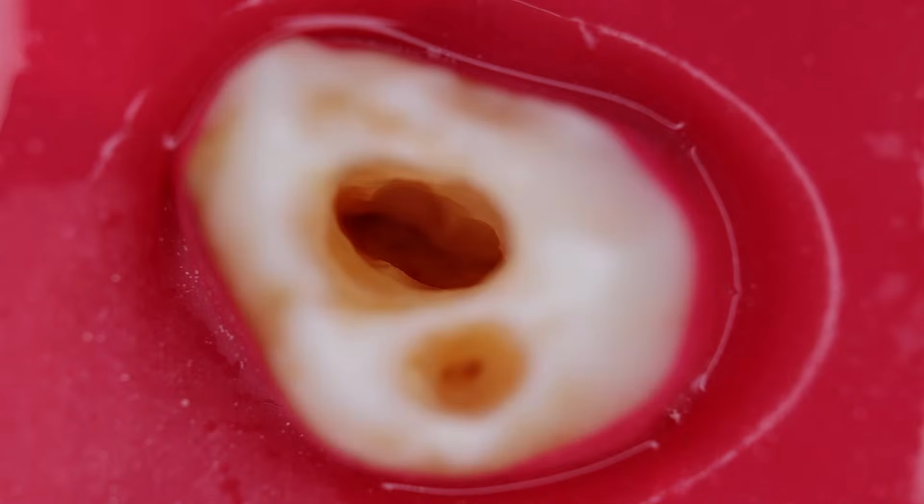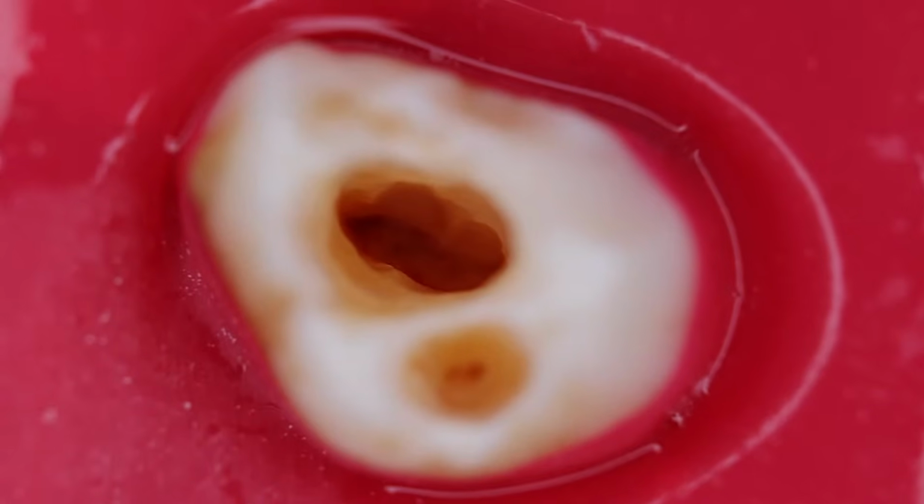So we have identified all the canals. In the next session we would begin with how we can enlarge these canal orifices to see them visually when we are not using the endodontic microscope.